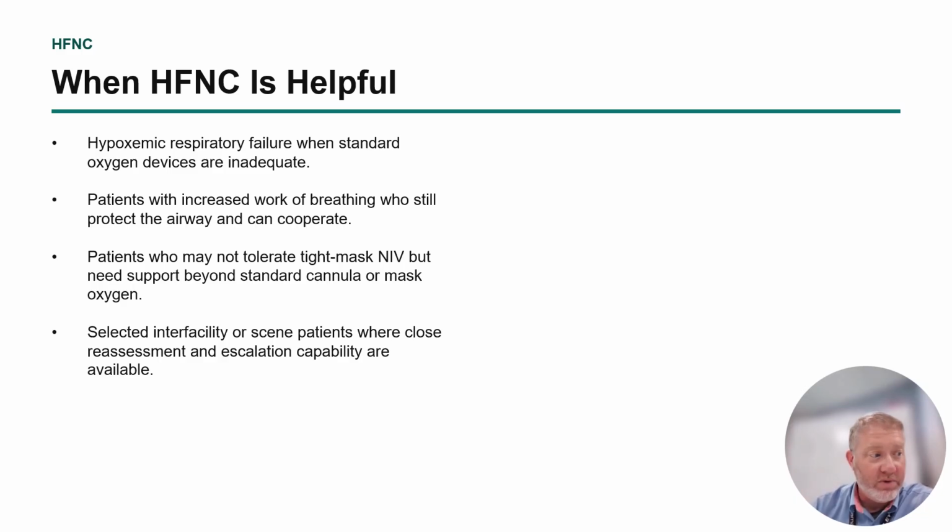It's also useful when comfort and communication matter. So somebody with pneumonia or interstitial lung disease who is uncomfortable with masks, high flow can be a great option for them. So the ideal high flow nasal cannula patient is hypoxemic, so they need supplemental oxygen. They're working hard to breathe, but they're still awake enough and alert enough to be able to manage their breathing on their own and their secretions to a degree.